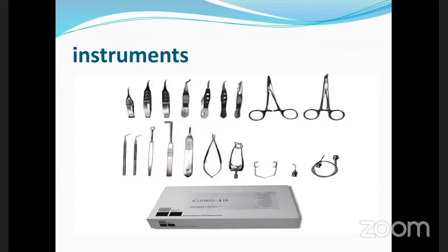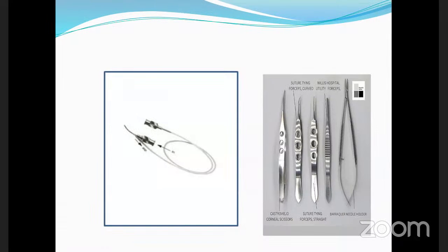So these are very small things, because suddenly you realize once you have landed in a complication and your Simcoe is also rusted, it's not working well. So you have to check the instruments before starting these kind of surgeries. I would just like to highlight the suture tying forceps, because they also have to be of very good quality. You will find that your needle holder is not there. Your suture tying forceps has been very old. So just check for these small things, because suturing the wound, practically you lose the practice of suturing the wound, and you find the forceps are also not working.